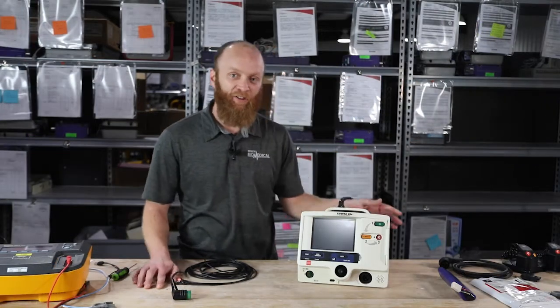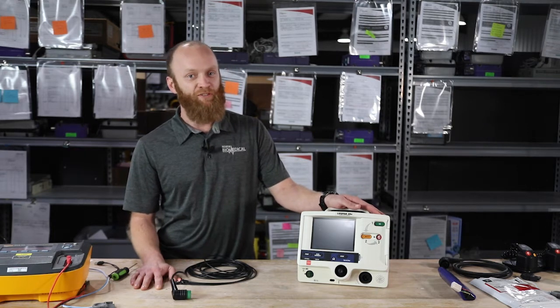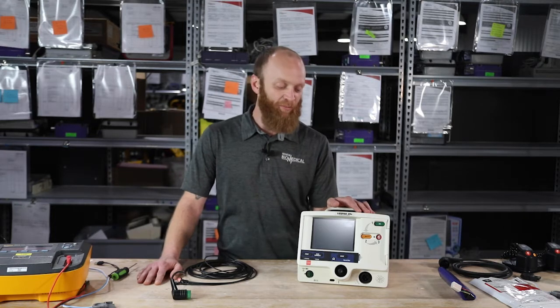I'm going to cover how to install the battery, paper, AED mode, and basic operations. We'll cover defibrillation, cardio synchronization, pacing, and basic button operations.